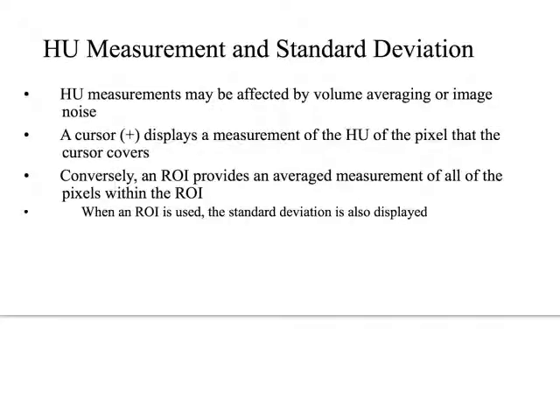So it's important to think about, and if you need an illustration of what that looks like, on the top of page 37, she's drawn an ROI on the streak artifact from the teeth. You can see it says a little number 1. She actually drew that on there. There's also an ROI placed on the patient's right kidney in image C. So she sampled what the kidney Hounsfield units are there. And it's expressed down here at the bottom.